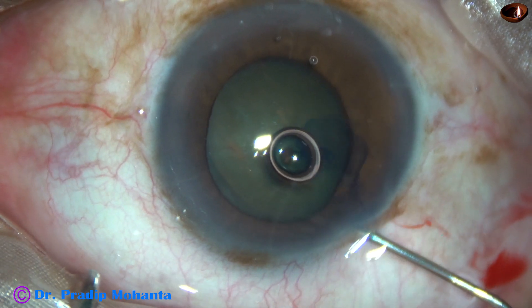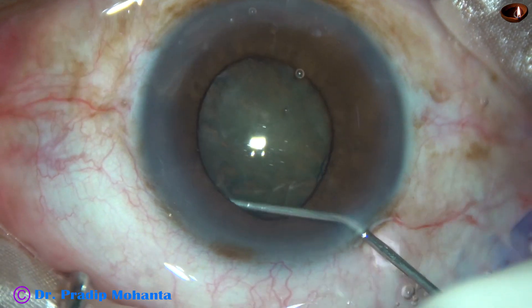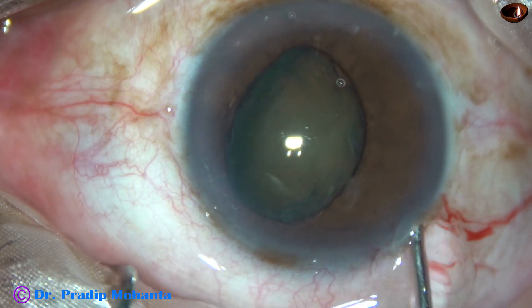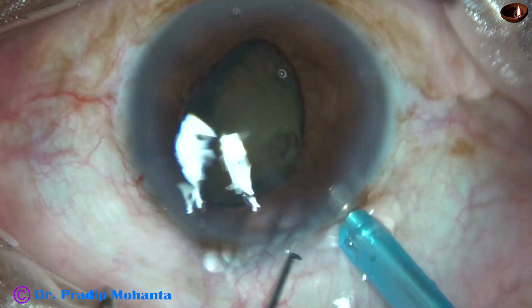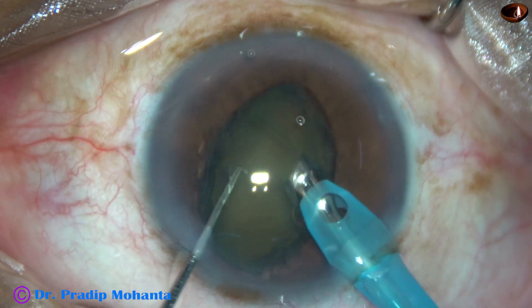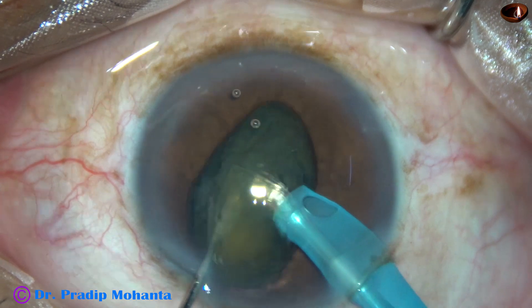Hydrodissection is done after expressing out some Viscoelastic. As soon as I injected Visco, the lens mass tilted. I thought of not repositing the lens mass, and decided to emulsify it in this position itself. So I am going to try to chop this nucleus in the standing position.